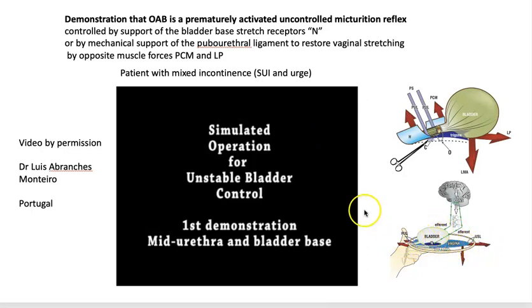The other part of the video you will see is that you can support the stretch receptors digitally, either with your fingers or even with a hemostat, to stop the afferent impulses. I will now show you the video.